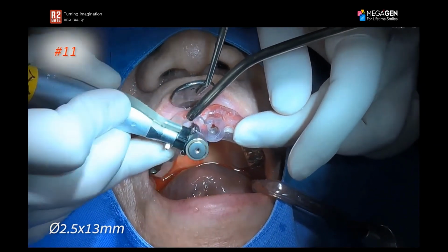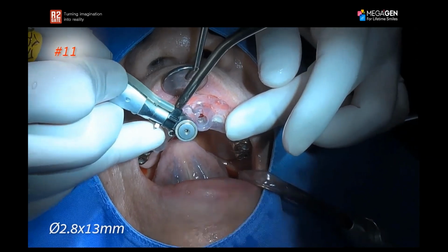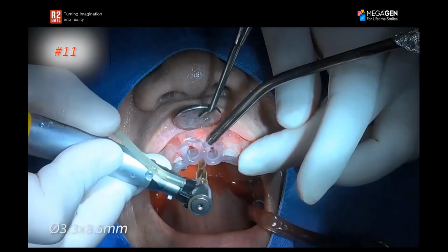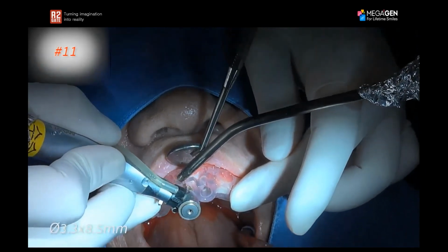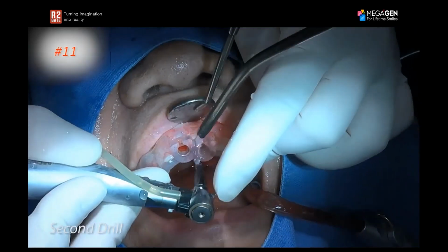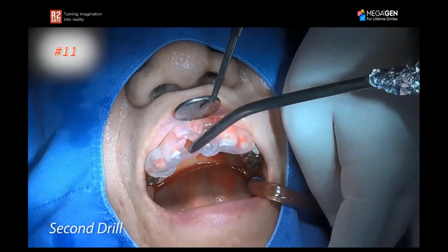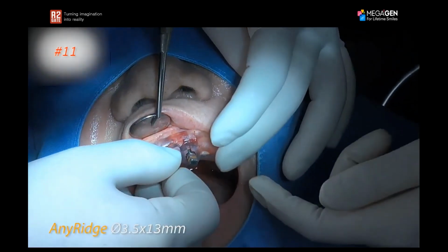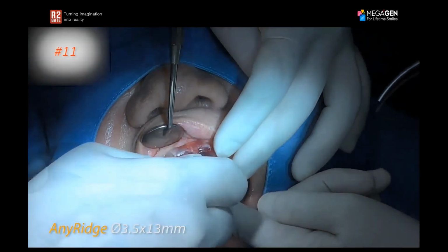So I'll go with 2.5 by 13 millimeter, 2.8 by 13 millimeter, and now the final drill will be 3.3 by 8.5 millimeters. And then again, I use the second drill to remove any bone that is around the neck of the implant. I'll place my other implant, which is also a 3.5 by 13 millimeter.